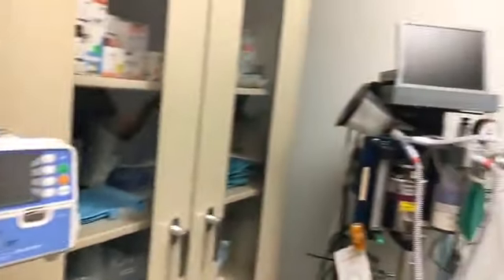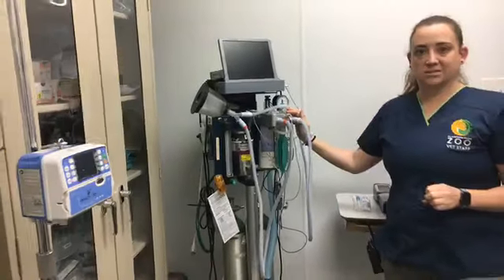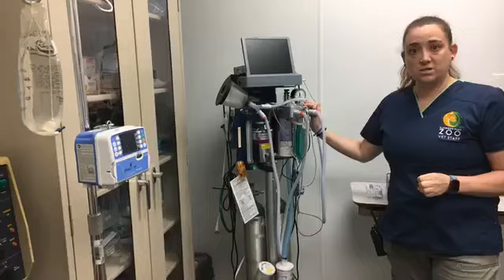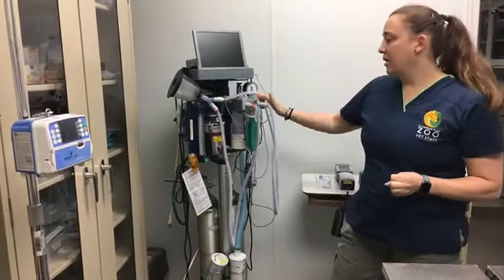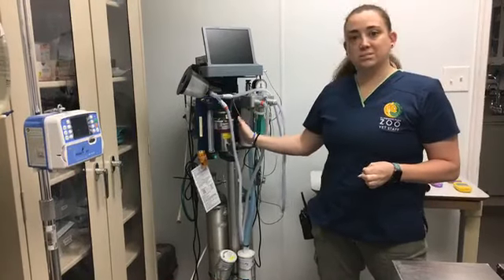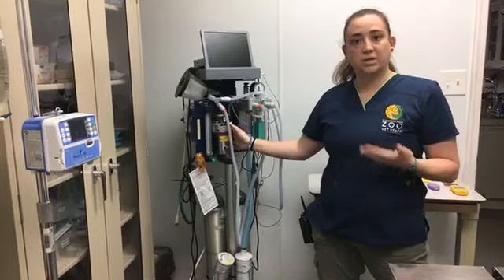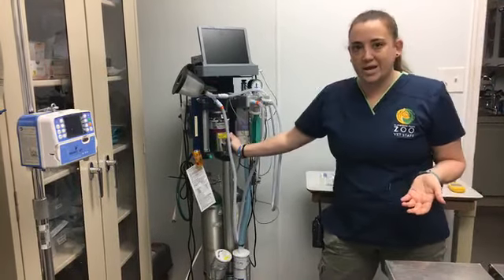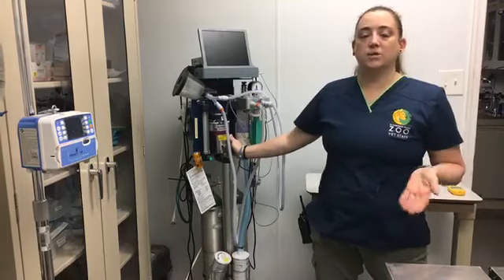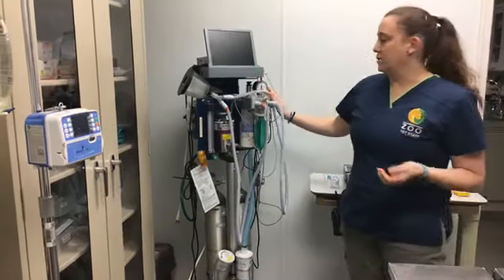Our fluid pump was actually donated by Spring House Veterinary Hospital — we're very appreciative of that. It allows us to give fluids to any patients that are having surgery or need it. And then this right here is our anesthesia machine. This is really important for our vet practice — it's one of the things we use most often. Any time we have to anesthetize an animal we use this machine. It uses oxygen combined with some gas to help them go to sleep and stay asleep while we're doing anything on them. You don't really want to do a jaguar exam awake, so in order to get hands-on we'll anesthetize them.